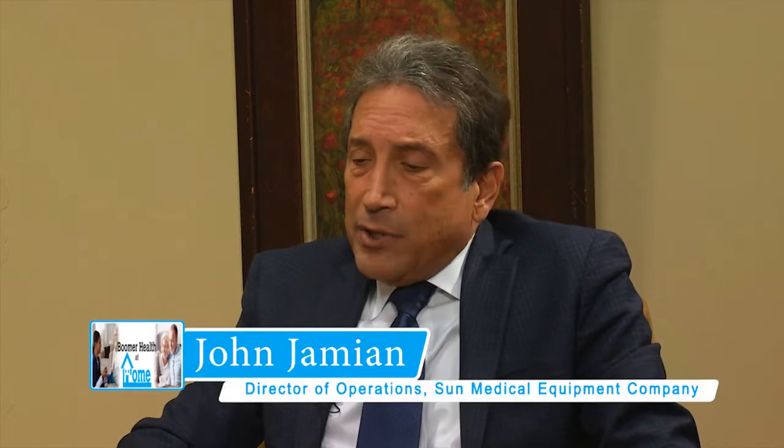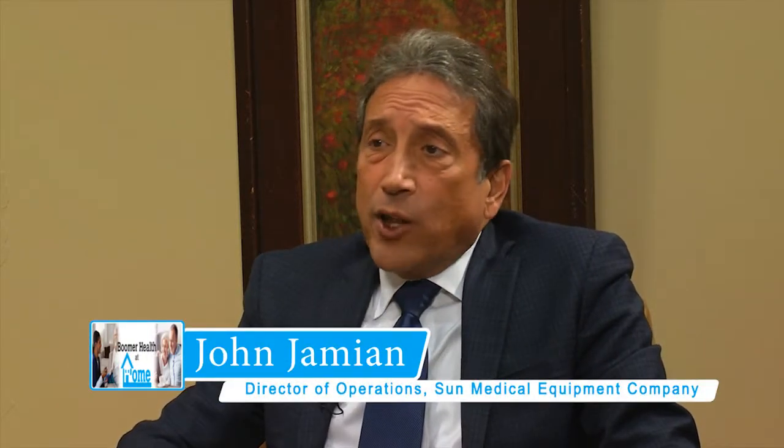That piece of technology has really allowed the industry to downsize their equipment and their machines. When pulse dose originally came out, it was a unit that you would hook up to a tank or another machine, but it did not give you the ability to get out and ambulate as well. All the thing did was really conserve oxygen. So if you had a pulse dose unit hooked up to your small cylinder, some people do, that conserves the oxygen that's in your reservoir, your cylinder, so that you can use it longer.